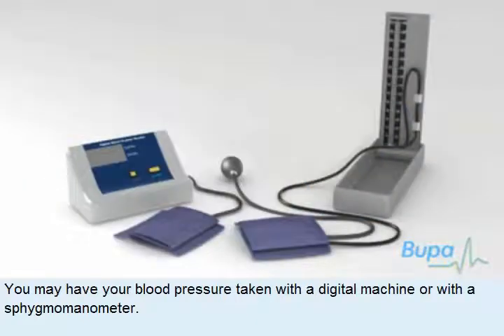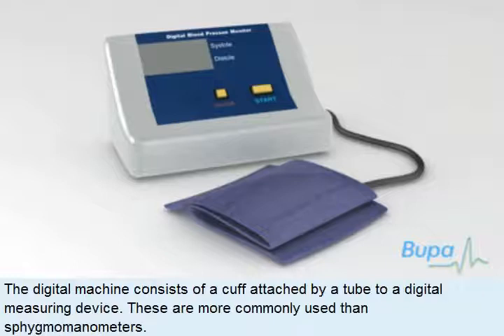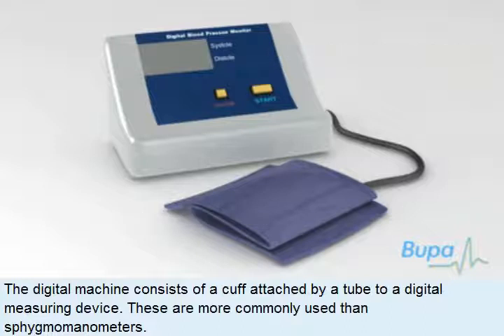You may have your blood pressure taken with a digital machine or with a sphygmomanometer. Here we show a digital machine that may be used to measure your blood pressure. The digital machine consists of a cuff attached by a tube to a digital measuring device. These are more commonly used than sphygmomanometers.